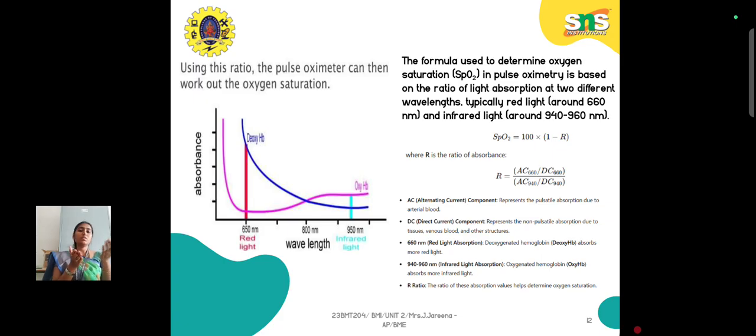So obviously in venous blood deoxyhemoglobin will be more compared to oxyhemoglobin, and in arterial blood the deoxyhemoglobin value will be less compared to the oxyhemoglobin. So based on that concentration only, your absorbance value will also follow the same pattern, right? If you have more, the absorbance will also be more. If it is less, the absorbance value is also less. This is how we calculate the respective oxy and deoxyhemoglobin for arterial and venous blood with the help of this graph.